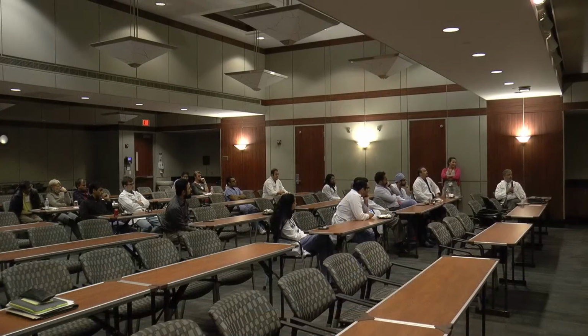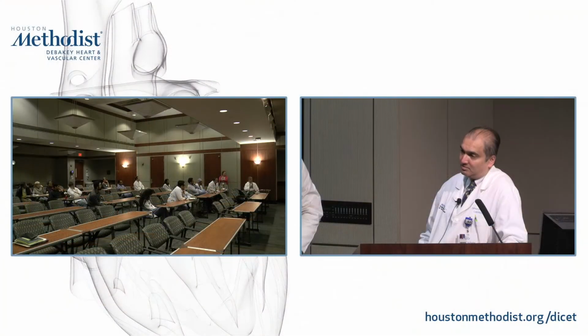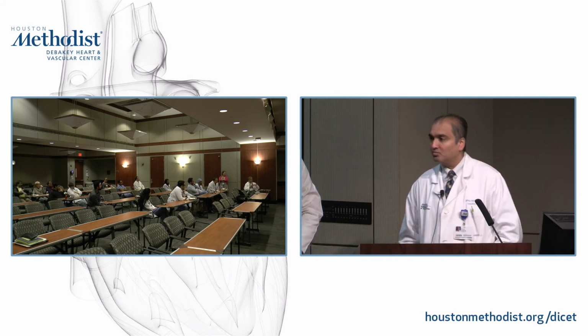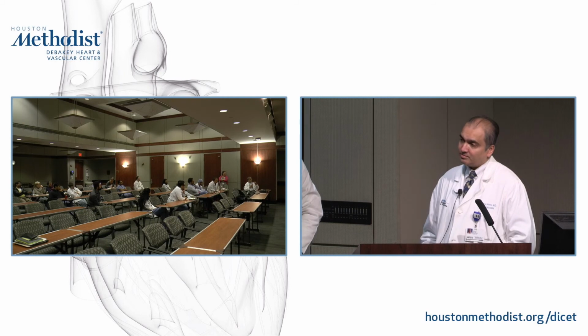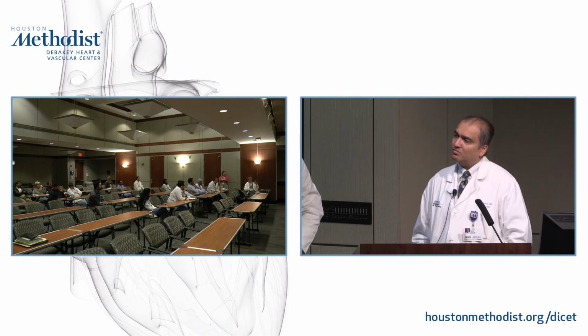Question for you. I've seen some cases where phase contrast gives some numbers that don't make any sense. I'll take an example that I've seen where there is significant AI, and the stroke volume forward and backward is quite impressive, and yet these numbers are small. So your regurgitant fraction is still decent, but the numbers are small. What could be the error there?